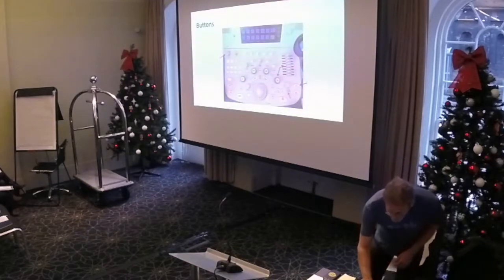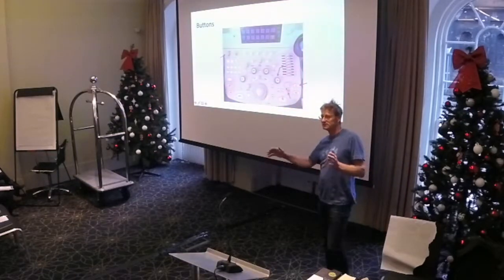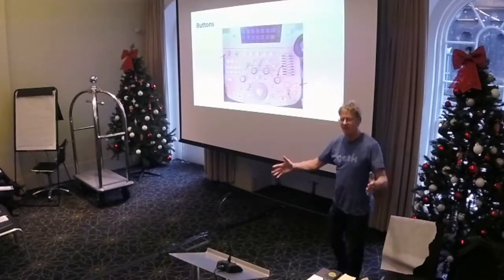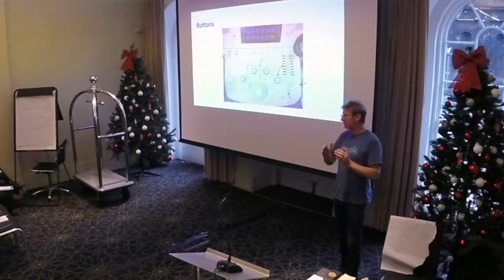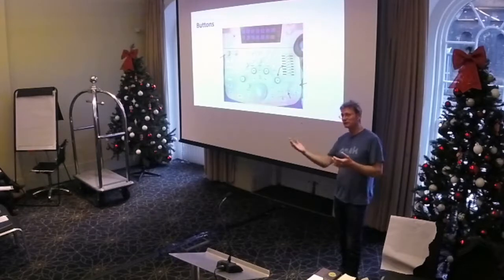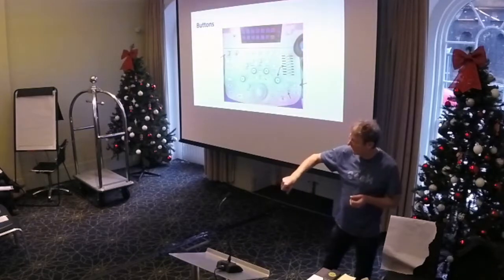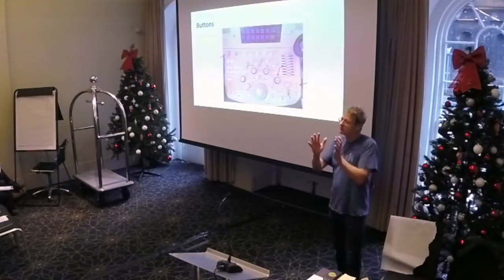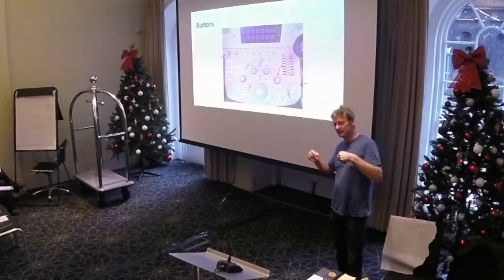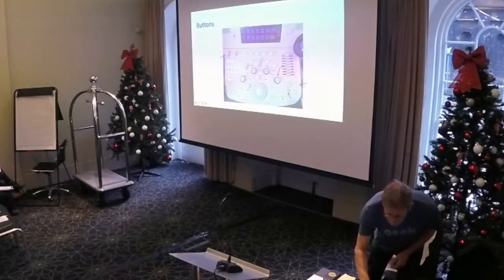The other one I want to talk about is gain. Gain is just amplification. It's like turning the volume up on a radio. It's not giving you a bigger radio, it's just turning the volume up, so it's amplifying the signal. It doesn't give you any more information, it's just making it shout at you more loudly. And of course, if you turn it up too much, you get that nasty hissy sound. So the rule with ultrasound is to turn your gain down as much as you can, and then just up a fraction. Make it go down until you lose the image, and then turn it up a little bit until you see it clearly. Then you're amplifying it at least, and then you're getting less additional noise because you haven't amplified it so much.